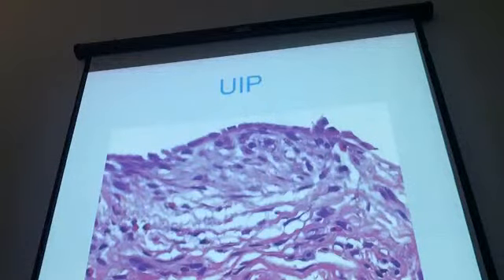It's thought that architecturally this is like a line, or these are continuous throughout the lung. But architecturally, if we were to be able to follow them along, they would be throughout the alveolus as a continuous area like this. But when we section them, we just see a small focus. Some people will also count these in a biopsy or in an area and use that as a measure of activity and how likely the person may be to respond to steroid treatment or so forth.